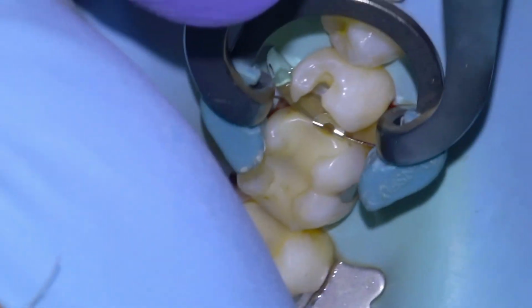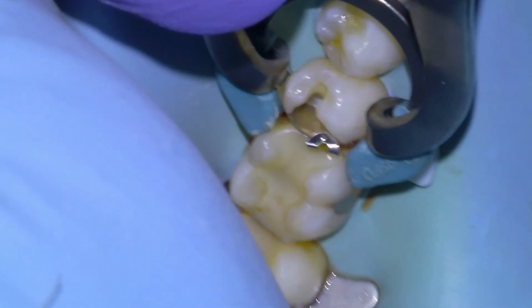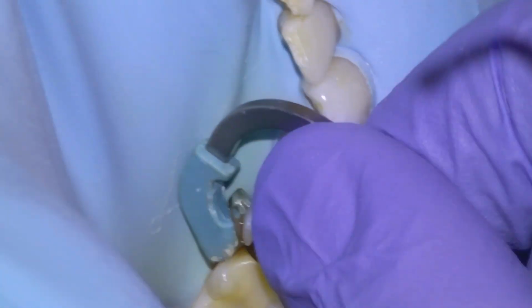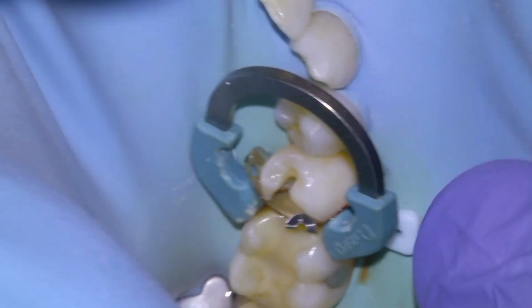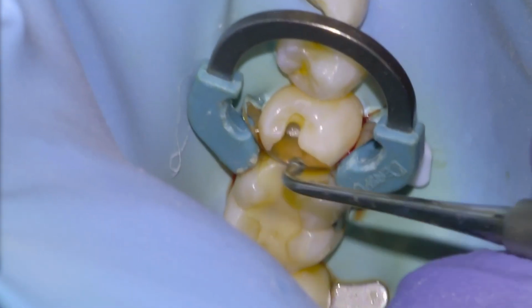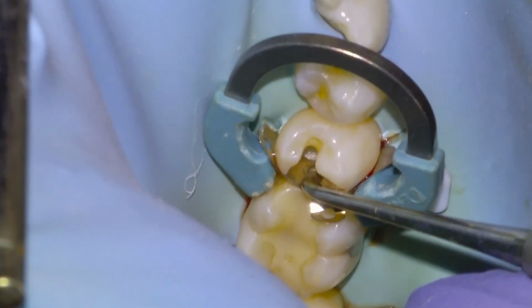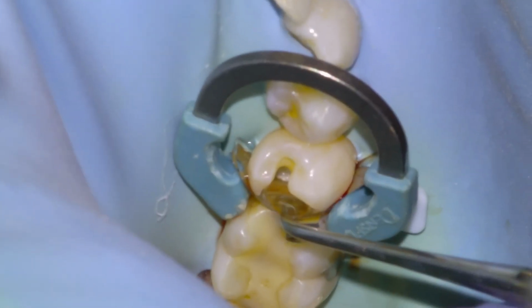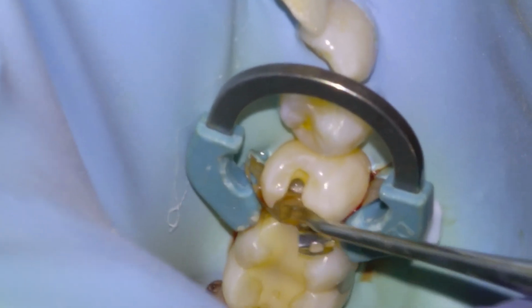And then the separator ring, I usually like to apply the separator ring and then give it a good shake with my fingers, kind of hold the teeth and hold the ring and wiggle it back and forth. And that forces the teeth apart as much as they can go. And then I'll seat it down as apically as it can once more here. And then we have the PDLs as stretched out as they can be so that we end up with a good contact. Gonna burnish the matrix against the neighboring tooth. And then we're gonna be ready to etch, rinse, and restore.